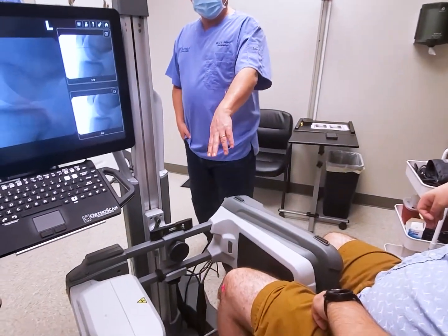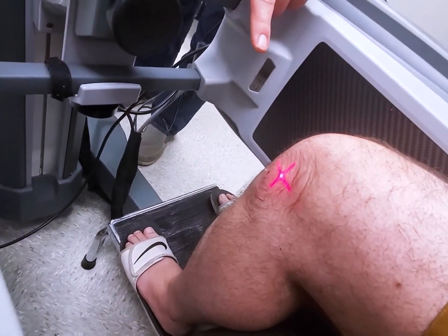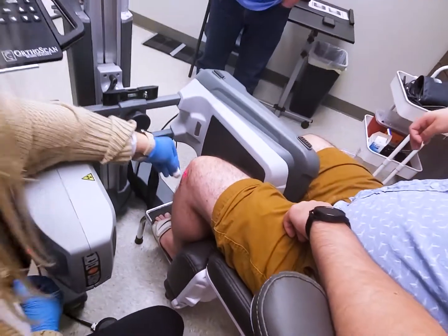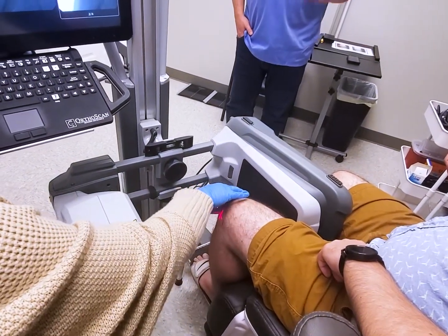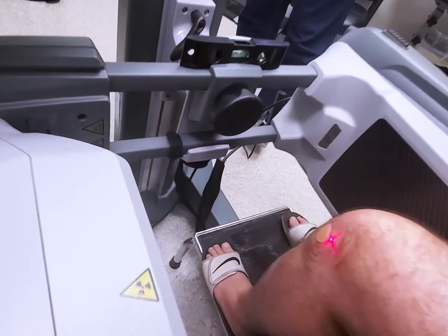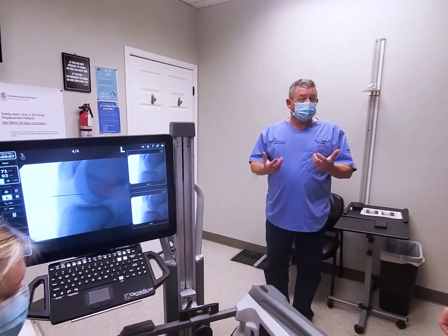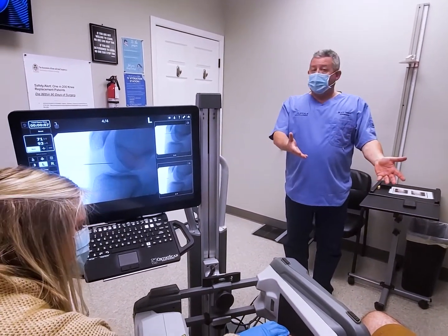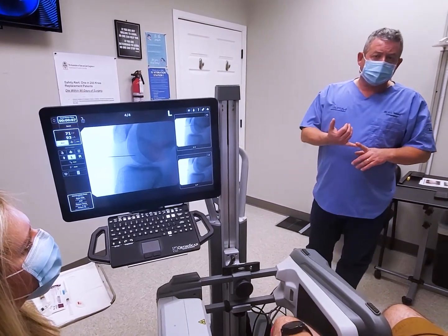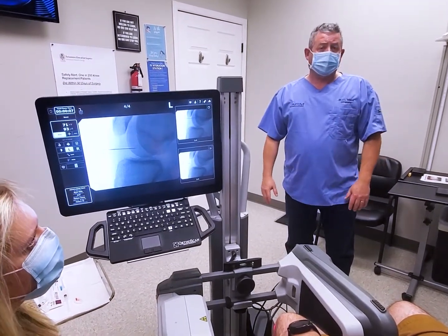Now, if you bring the camera down and you show where the injection site is right there, you can see that literally there's just a tiny mark where the injection was. We're going to put a Band-Aid there, but it's an incredibly small injection, and that's it. The patient walks out the door with a Band-Aid. Boom. And we encourage people not to go home and sit on the couch. It's important that you move around because that's part of how the material gets distributed and touches all the surfaces. So if Johnny wants to go play golf, that's fantastic. The 2 things we ask people not to do is jumping jacks or jump out of an airplane. Other than that, go shopping, go play golf, go about your life. There's literally no downtime.